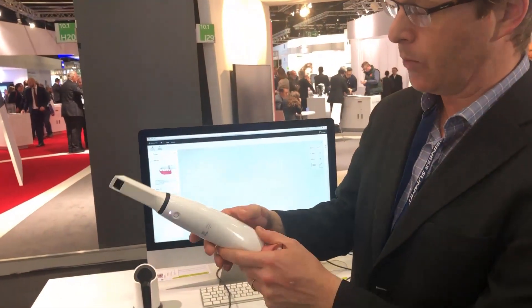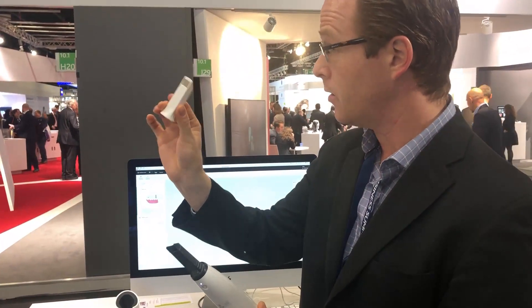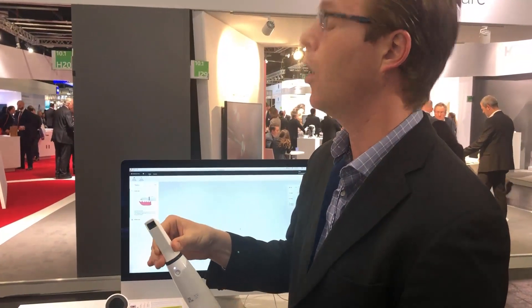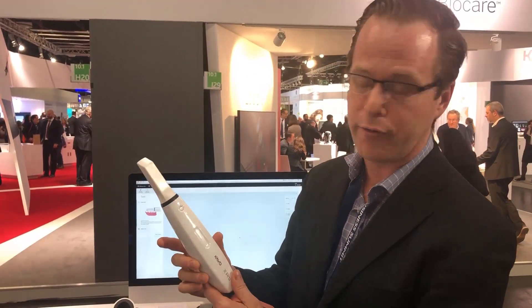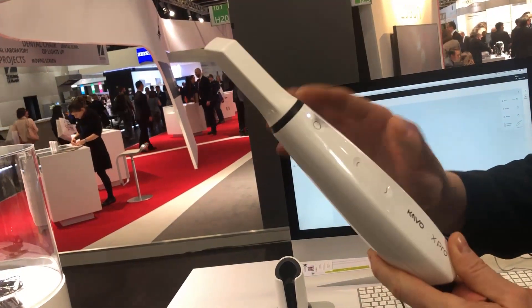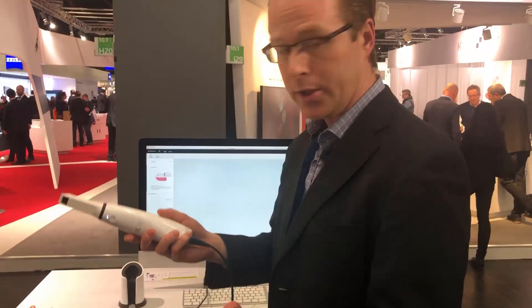The handpiece is lightweight and sterilizable. It's a single-use tip but no cameras on it. What's nice about the scanner is there's no actual physical buttons — it's just a touch interface, but it does have a nice recess for a button. It also connects via USB to Mac and PC.